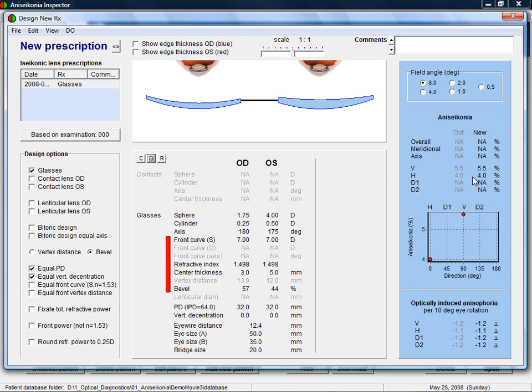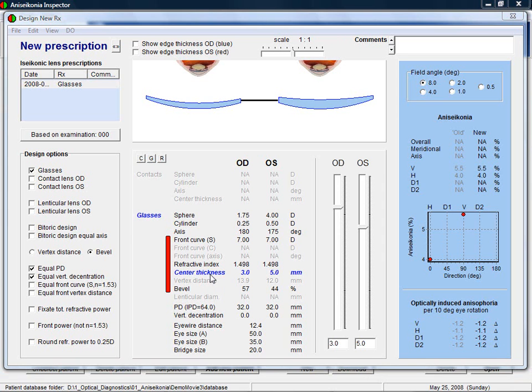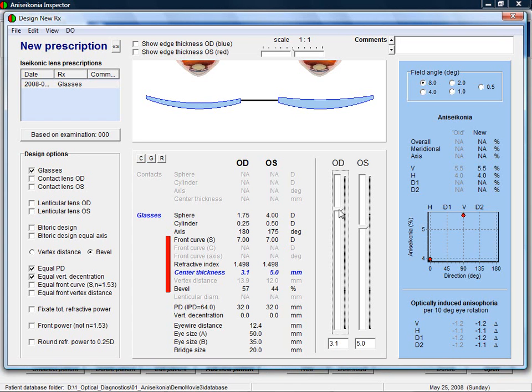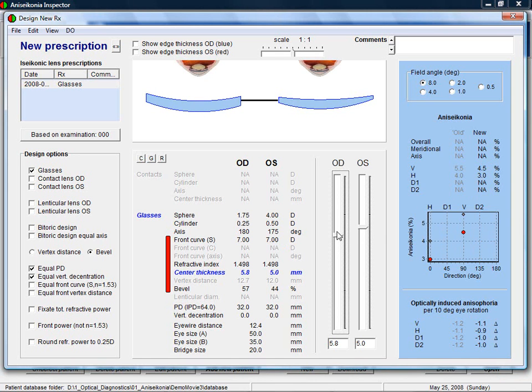The aim now is to change the new prescription to reduce the aniseikonia by 3%. The different parameters of the new prescription can be changed by simply clicking on these parameters or their values. For example, let's change the thickness of the lenses. By moving the slider bar of the right eye lens, it shows that increasing the thickness results in less aniseikonia. Let's make the right eye lens 7mm thick.